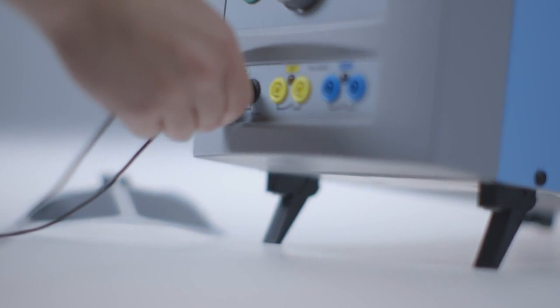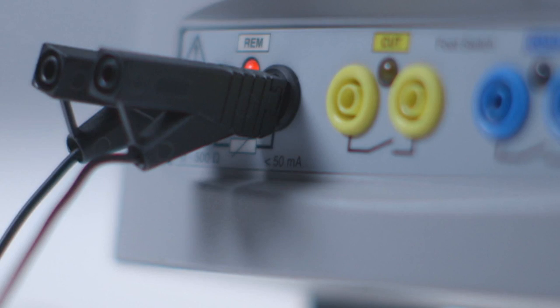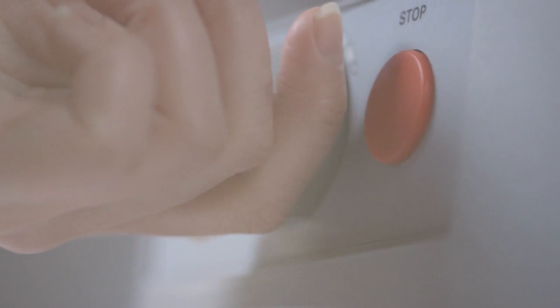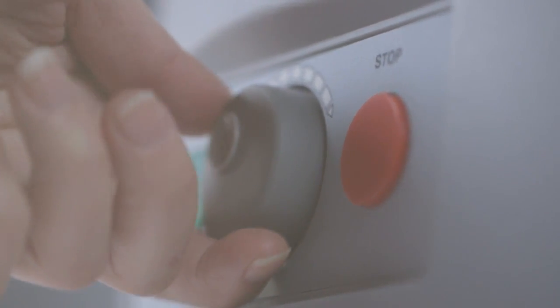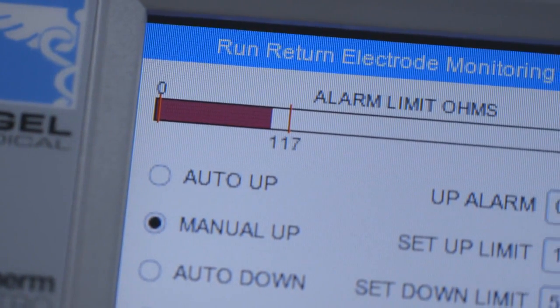The UniTherm's accurate CQM function simulator allows automatic and manual increase or decrease of electrical resistance values in 1 ohm resolution.